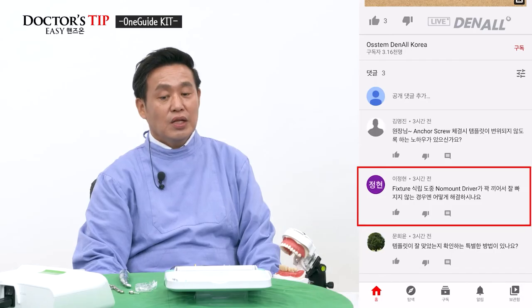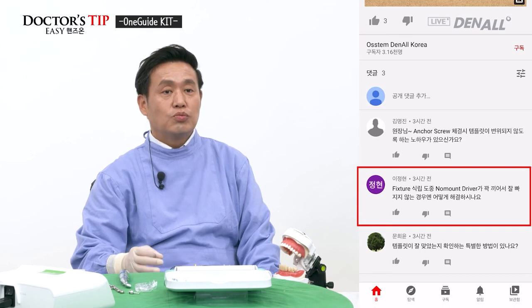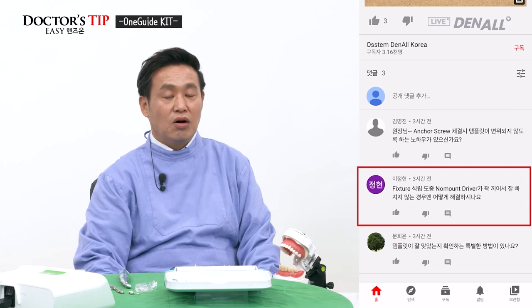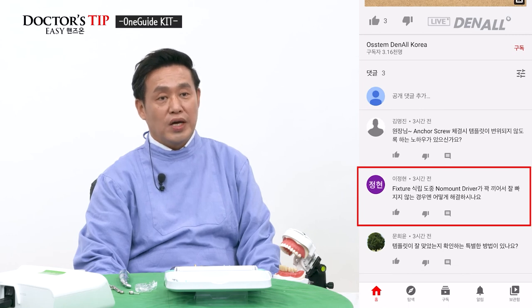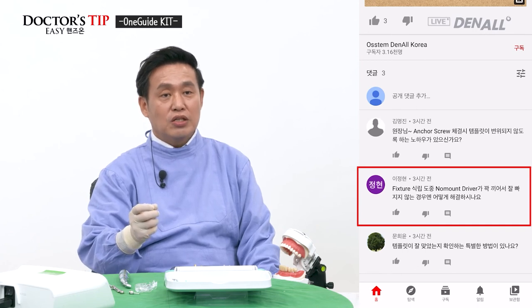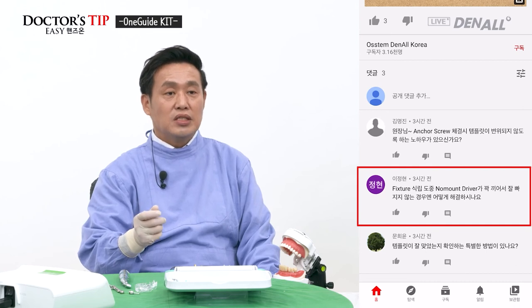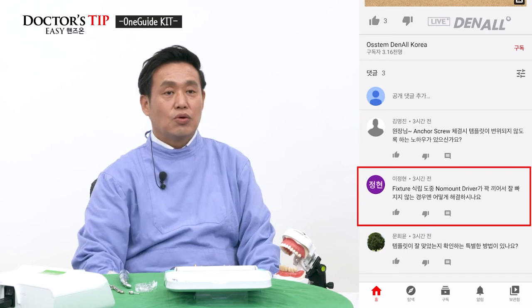I've mentioned this in my lecture briefly. Basically, compared to guide hole, the barrel of drill is slightly smaller. And no mount driver is smaller than that. This is so to minimize jamming phenomena. However, at times when we use template to place implants, it can get real tight. And when you use engine, in other words, if the torque is high, reverse the engine slightly, almost as if you're removing the implant. And once you do that, it gets loose.